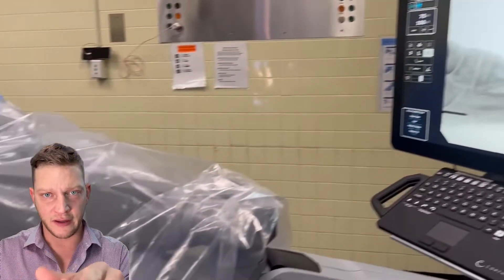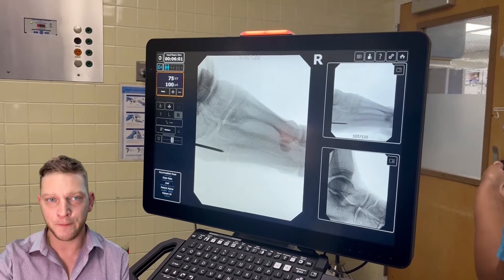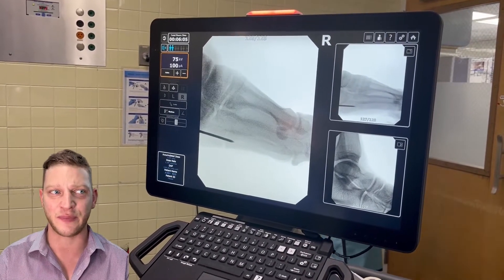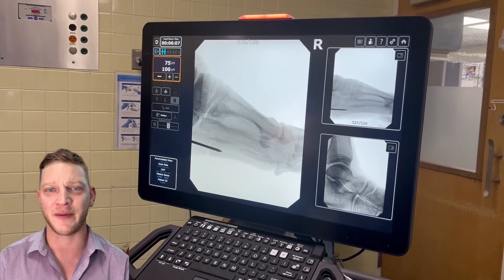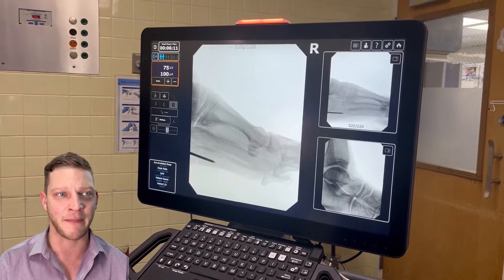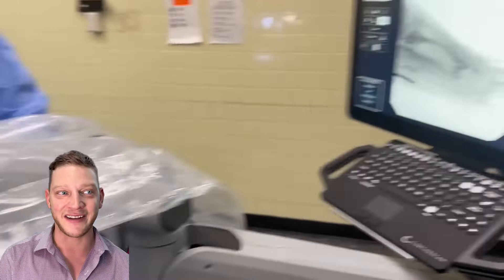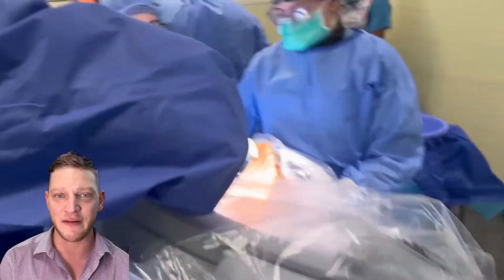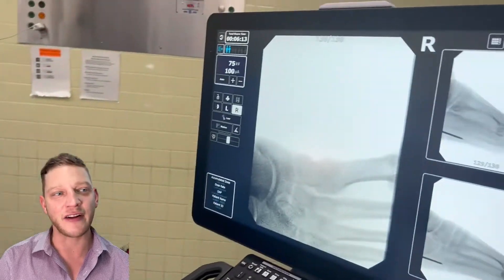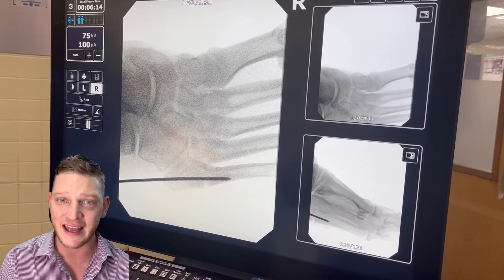When doing x-rays to confirm the K-wire is in the right place, you need at least two views. Here's the lateral view — I'm getting it, this is beautiful footage. On the lateral it looks great. Now let's take a look at the AP view. On the AP, it looks like I'm sciving a little laterally — that's just too lateral. I have to try again.